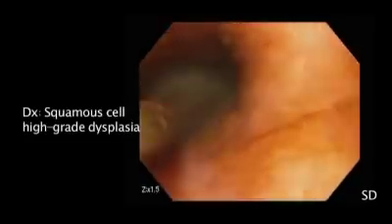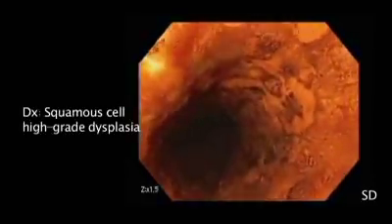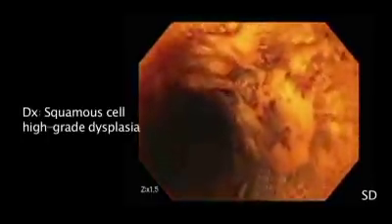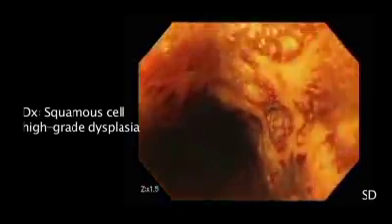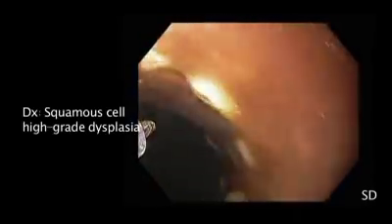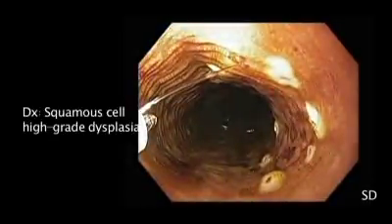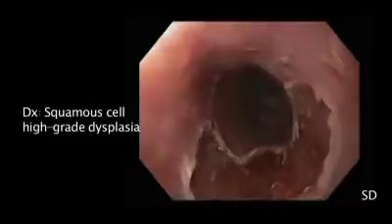The use of Lugol's has been shown to improve the endoscopic detection of high-grade dysplasia and squamous cell cancer of the esophagus in patients at increased risk. As illustrated in this case, the application of Lugol's solution aided in the endoscopic diagnosis of dysplasia. The sharply demarcated unstained epithelium delineates the dysplastic lesion from normal squamous epithelium. This is a crucial component in order to define the lesion borders and assess for the completeness of resection.